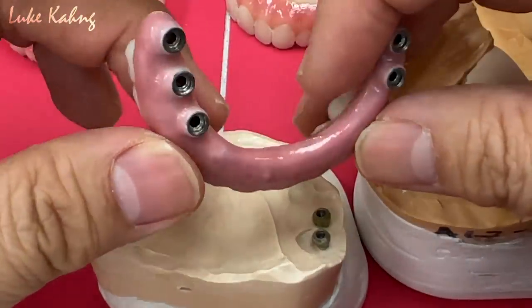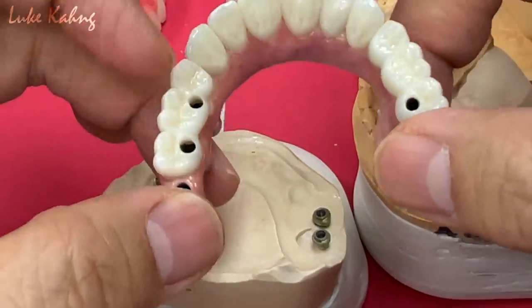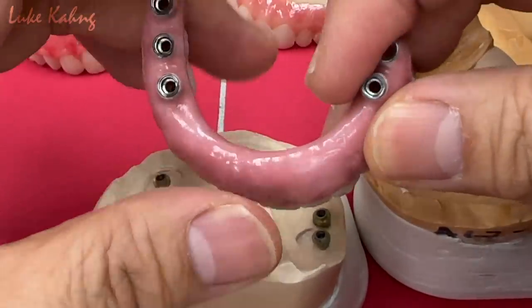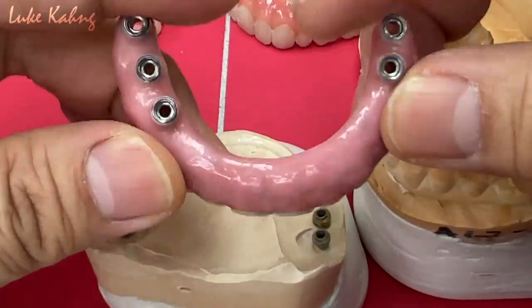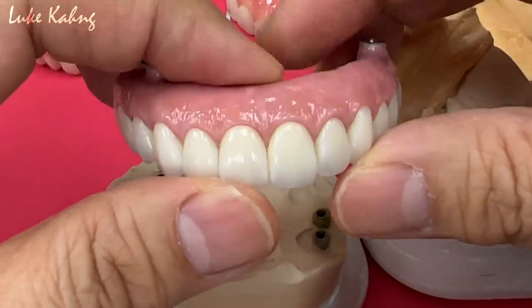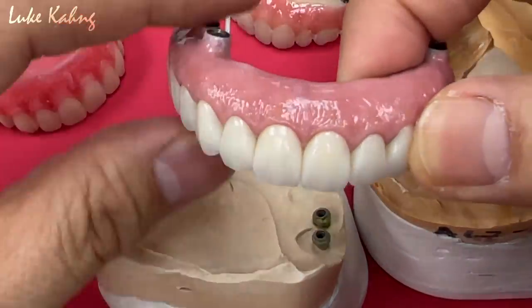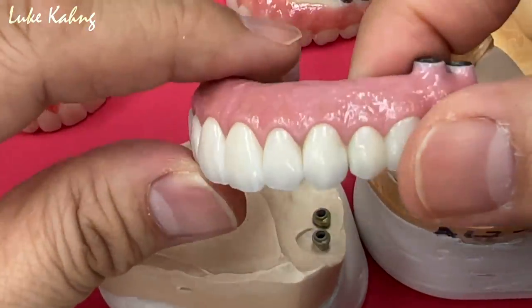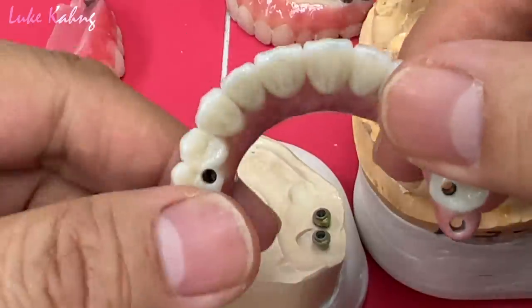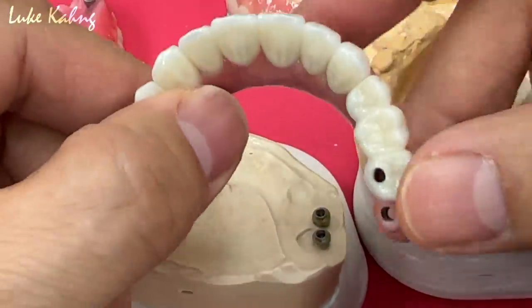So we're using the top of the line hybrid bar inside, we make the scan and design, and then you saw all my previous journey. So this is final. It takes quite a bit, looks like 3 weeks easily, but from the wax try-in, the verification jig, I would say it's almost 3 months to get there. So people are asking about that, so let them know this is a $7,000 plus part. Just let everybody know, so many questions about that.